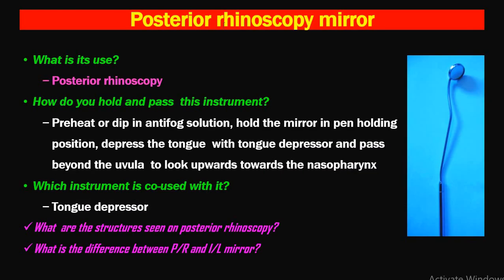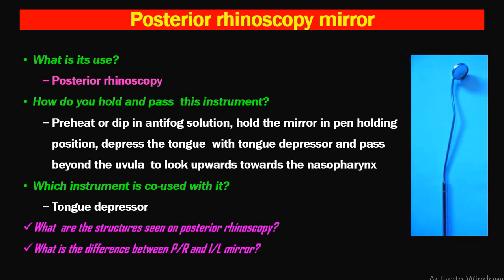Next is the posterior rhinoscopy mirror. There is a difference between the indirect laryngoscopy mirror and the posterior rhinoscopy mirror. The posterior rhinoscopy mirror is bent, with an angulation of around 150 degrees. In the case of the indirect laryngoscopy mirror, the shaft is straight and the angulation from shaft to mirror is around 120 degrees, because the nasopharynx is located more superiorly and posteriorly, while the larynx is located more inferiorly and anteriorly.